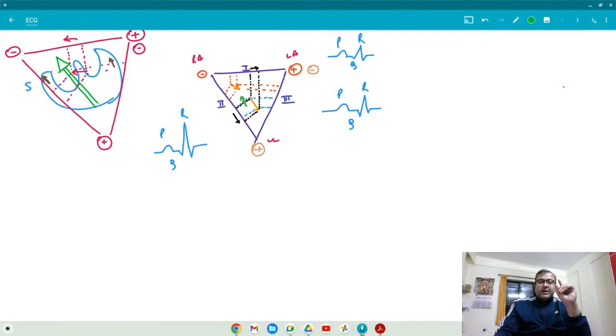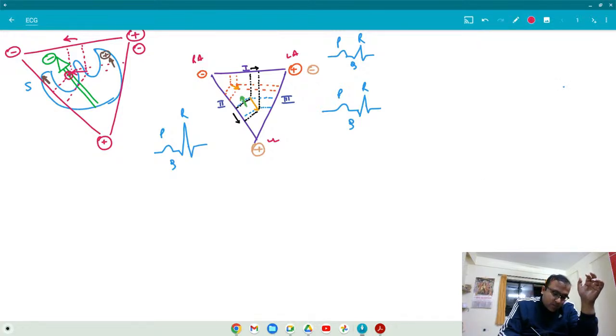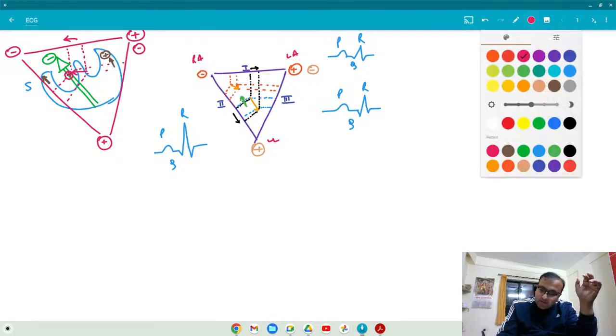One thing, remember. Repolarization is electropositivity or electronegativity? Electronegativity moving towards the anode. Observe it. It is in front of you. This one is electronegativity. Whatever we have discussed until now were all electropositivity, but this time we are discussing electronegativity.